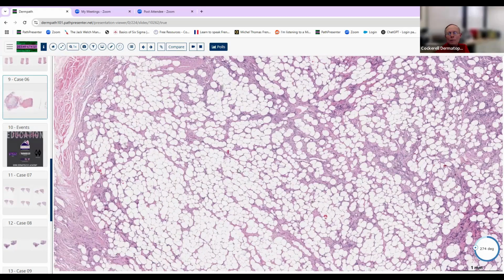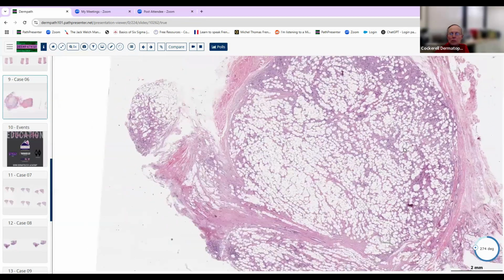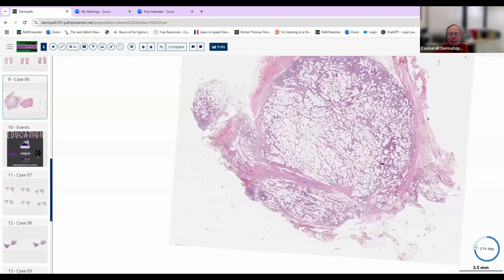So I think we thought this was possibly an unusual fibroneural fatty hamartoma. So not anything really to be too concerned about, except just to understand that you get these various fat tumors that give you these other components. Now, if you know angiolipoma, for example, that's one of the classic painful tumors. They could end up asking you that on the board examination.